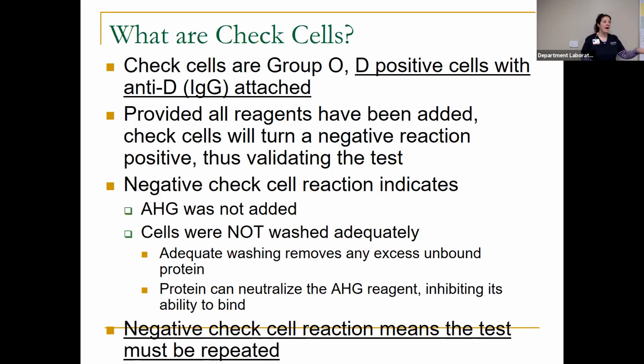All right, you guys will see this in lab. You'll get plenty of experience. Not today in lab, but next week we're going to start adding in the AHG and check cells. Okay, so you guys will get practice with this.